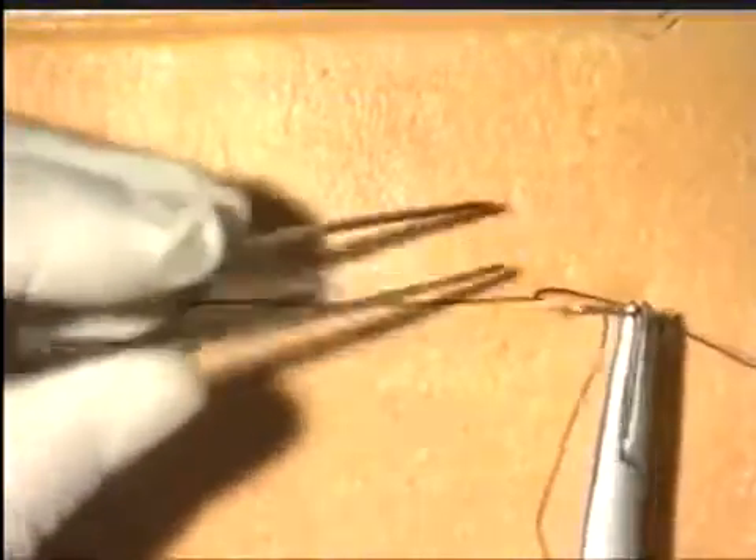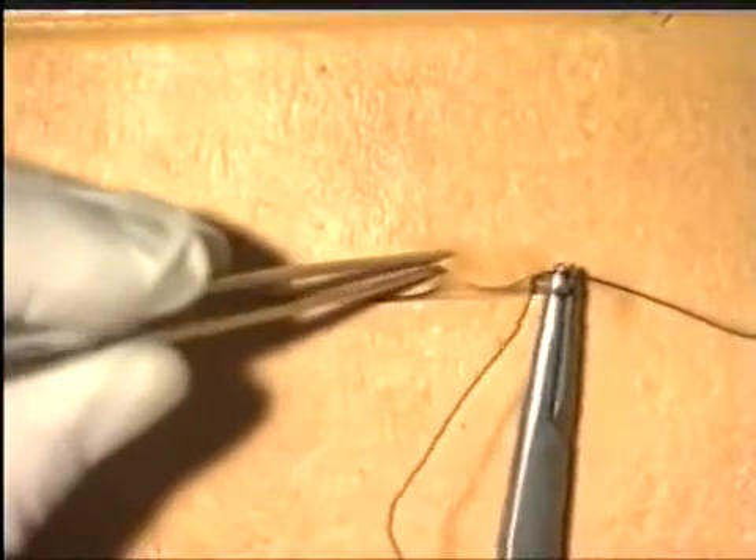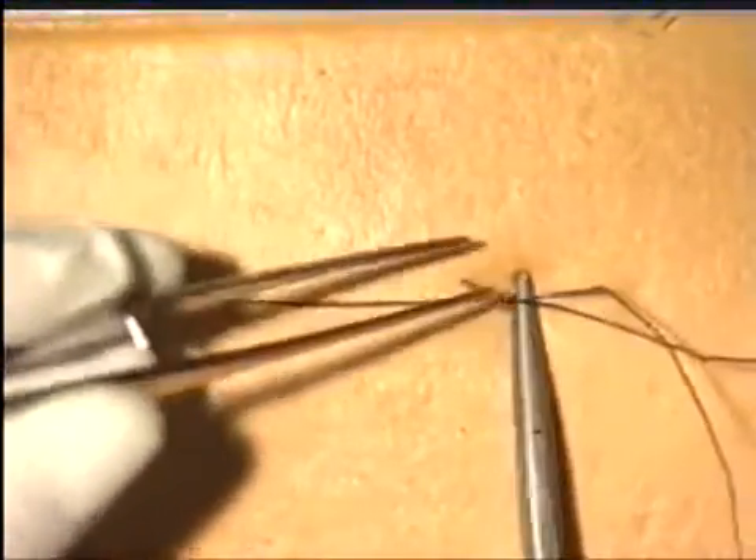Each new suture must be inserted almost opposite the exit of the previous suture, and this ensures that as the suture material is tightened it draws the wound edges together almost in the manner of invisible mending.